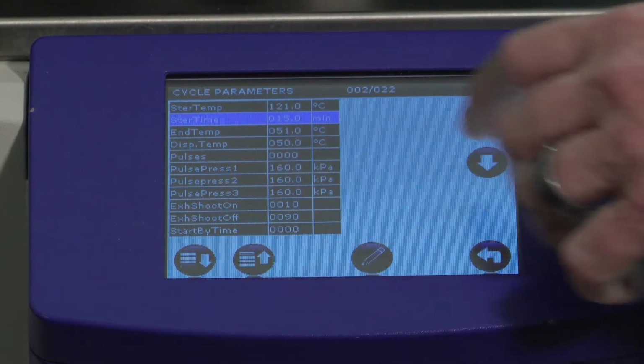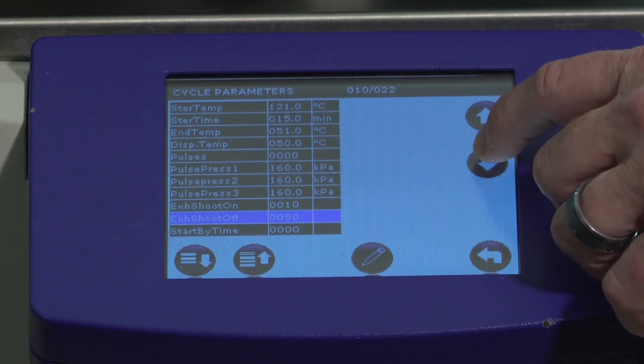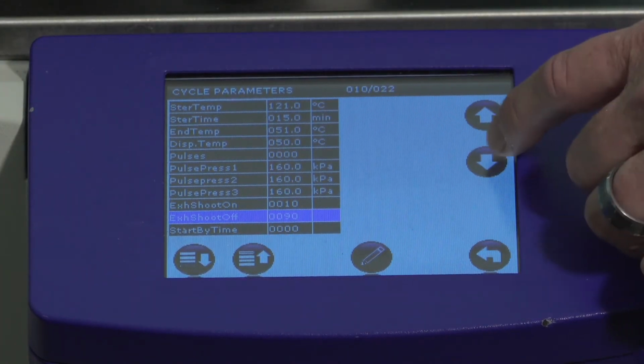So there are a lot of other pieces in here that are not necessarily something that everyone would program, because I am in the admin password.